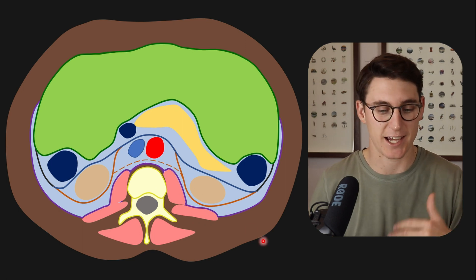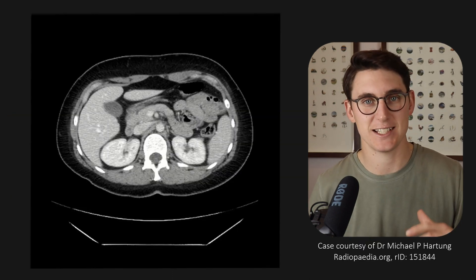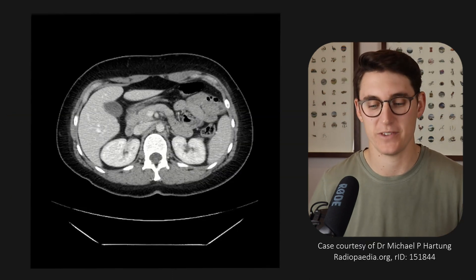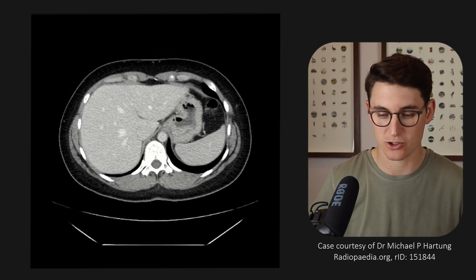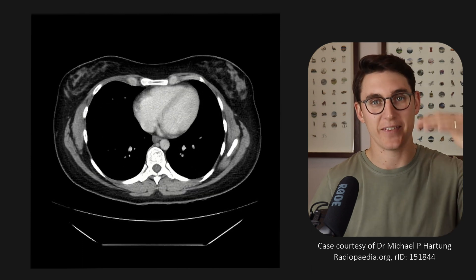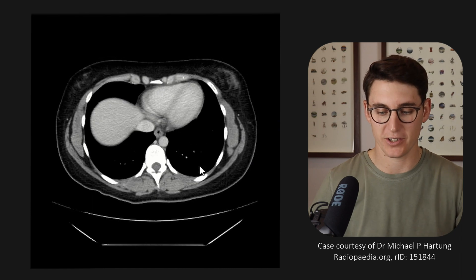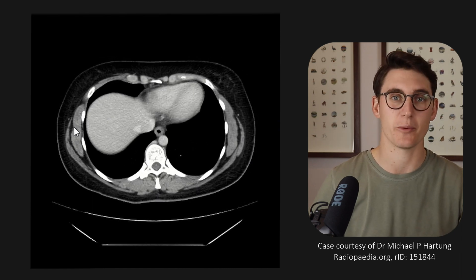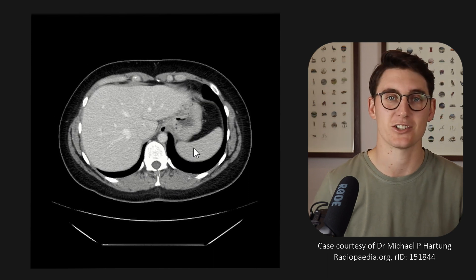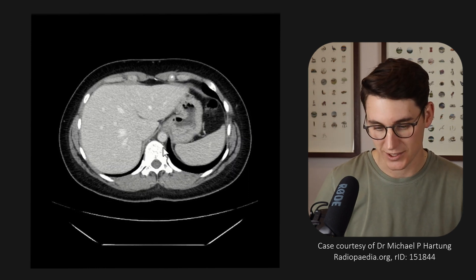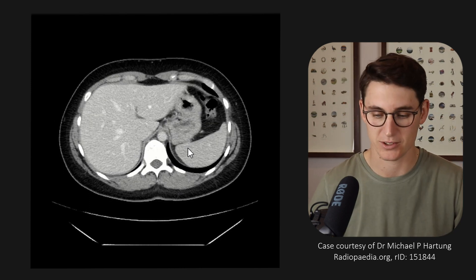Let's have a look at a CT scan and find those organs. Here we have an axial slice CT scan — a normal scan of the abdomen. As always, I'm going to start in the thorax when looking at the abdomen, and scroll all the way up before heading inferiorly. As we scroll inferiorly we can see our liver coming into view on the patient's right hand side and our spleen on the patient's left hand side. We can see the diaphragm here separating the thoracic cavity from the abdominal cavity.